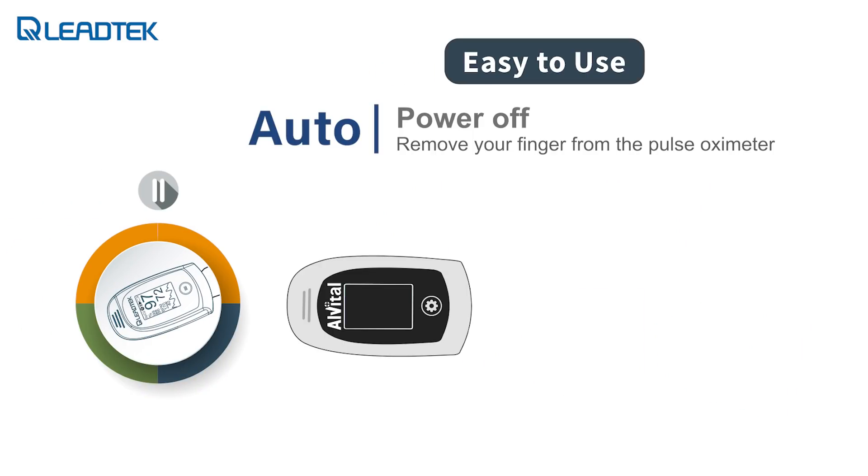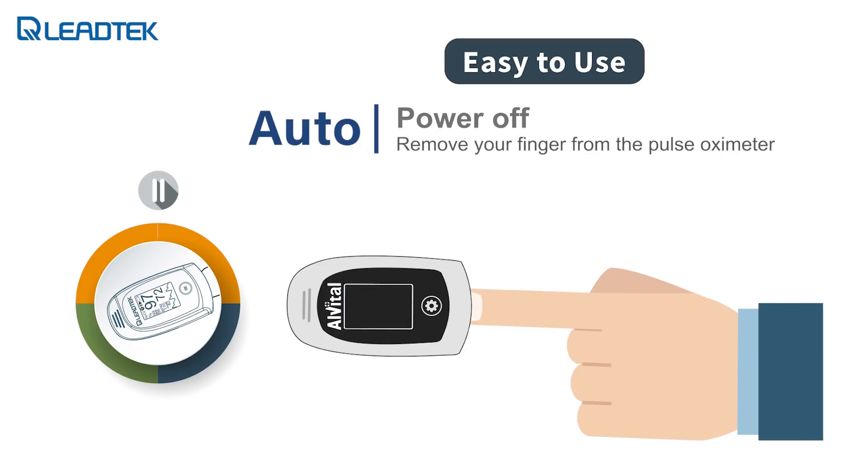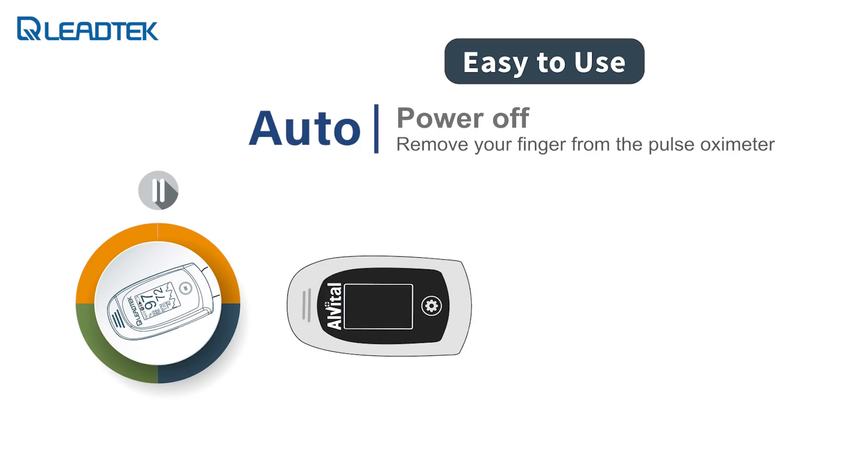The AT101 has sensors that detect when a user inserts a finger into the device. The device will turn on automatically and start the measurement. When the fingertip is removed, the device will also turn off automatically. The button on the device is only used to change the settings.